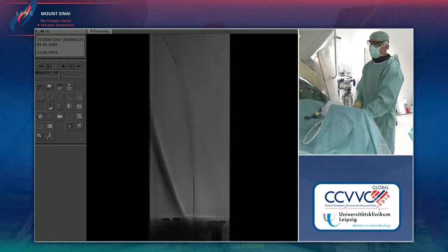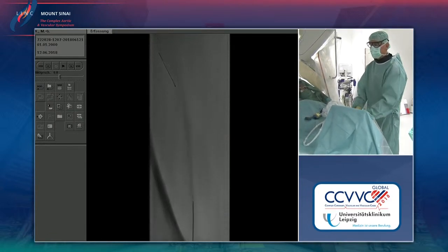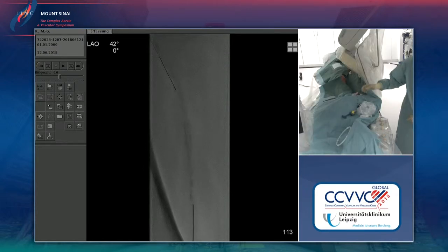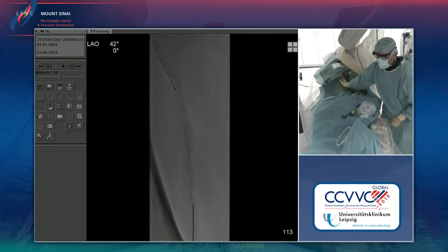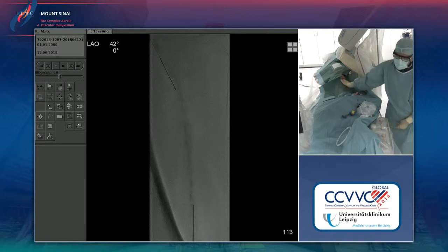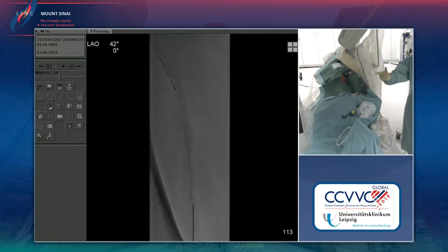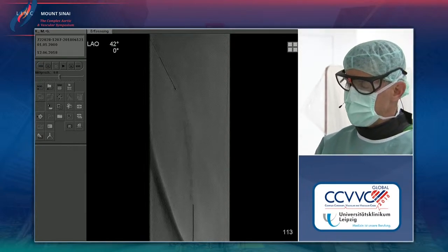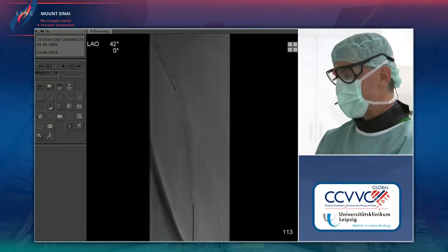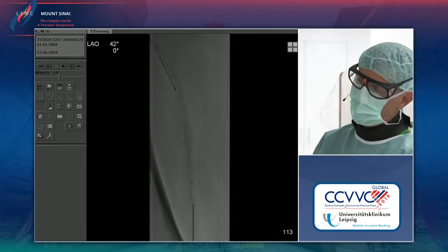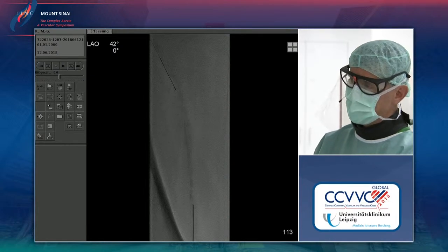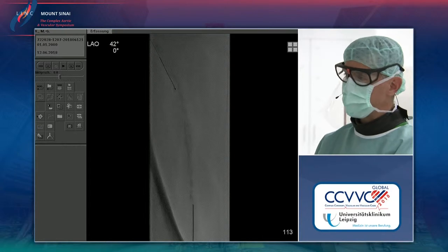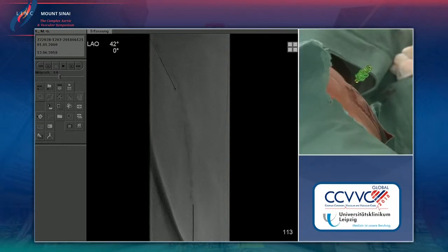In these cases, a puncture of the proximal anterior tibial artery would potentially be easier. We had a little bit of a problem here with local anesthesia — the patient is relatively sensitive in that area proximal to the knee on the medial side. So I took this 9 centimeter 21-gauge needle and with stepwise administration of local anesthesia went down to the artery. I left it here as I don't want to pull it out again to find the route down, which may be a little sensitive.